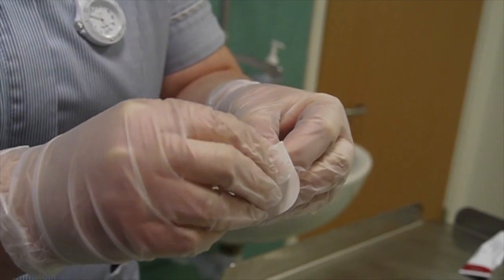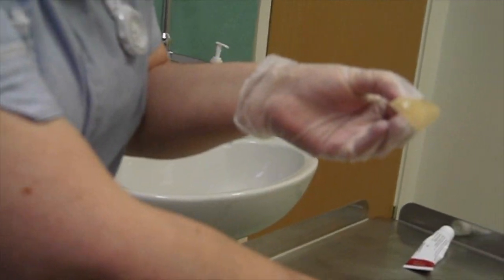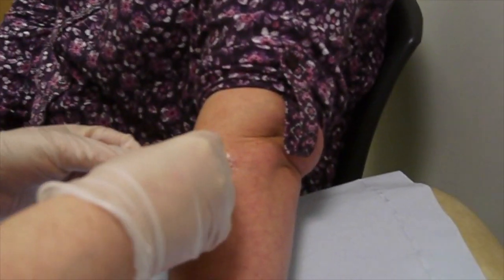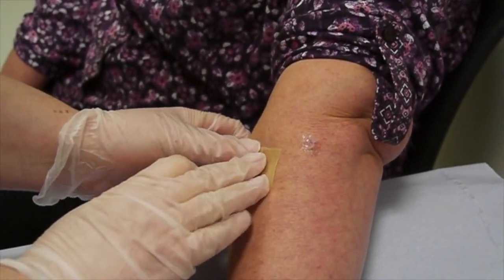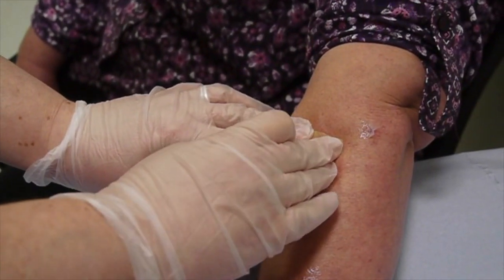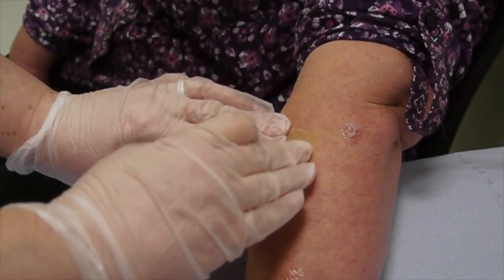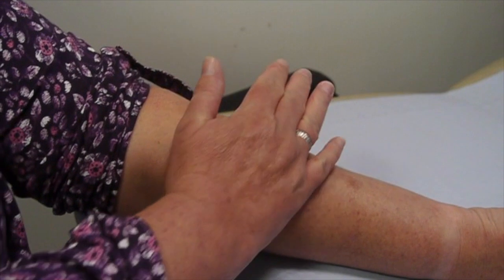The paper backing is taken off the back of the hydrocolloid dressing revealing the adhesive side, and now the hydrocolloid is being applied over the patch of ointment over the eczema. The nurse is just going to ask the patient to apply her hand to warm it for 20 or 30 seconds, and this helps it stick more effectively.